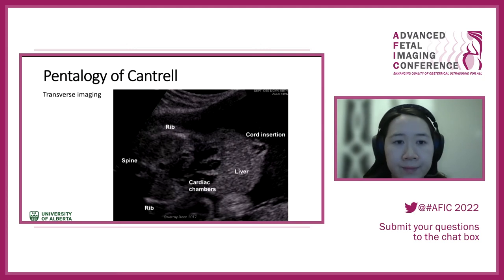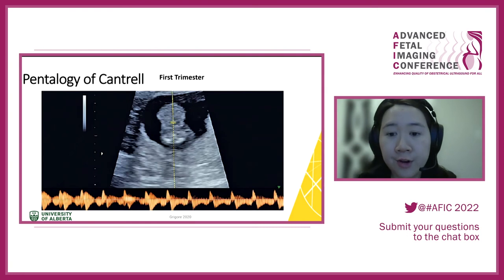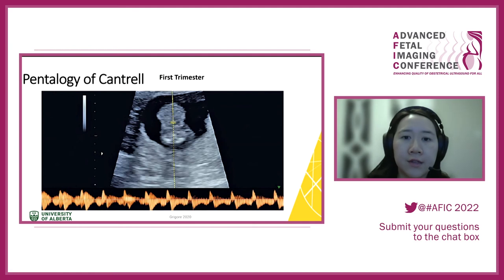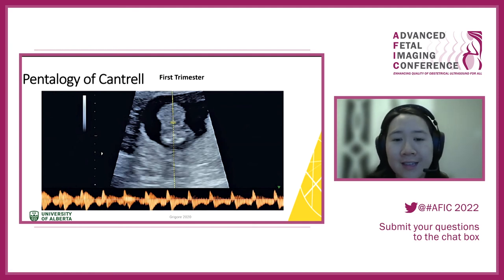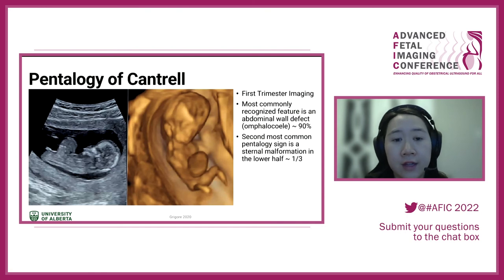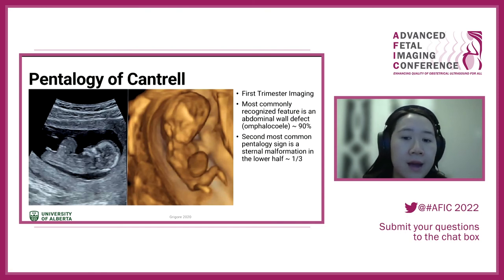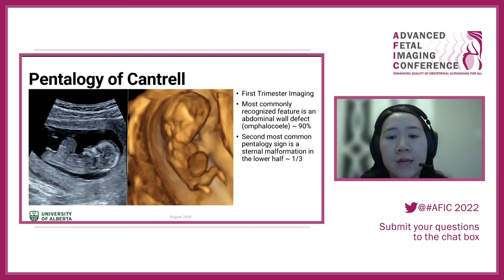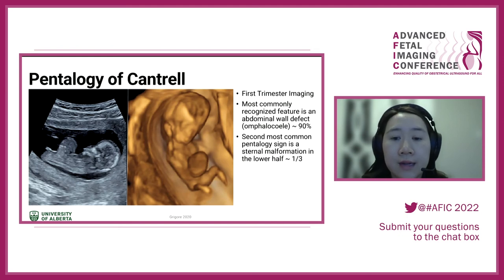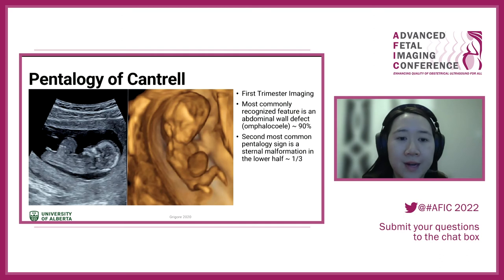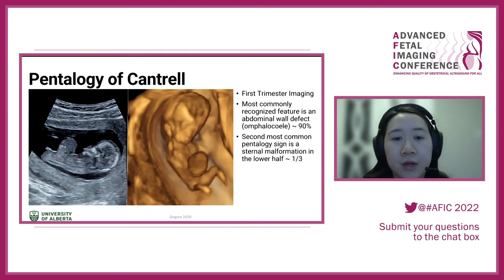Pentalogy of Cantrell can be diagnosed in the first trimester: if you see a possible omphalocele and the heart looks more anterior than expected or appears to be entering an anterior ventral wall defect, be concerned about possible pentalogy. The most commonly recognized sign is an omphalocele in 90% of cases. The second most recognized sign is that the omphalocele seems to extend anteriorly more than expected — that sternal clefting. The least recognizable sign is ectopia cordis, where the heart is outside.